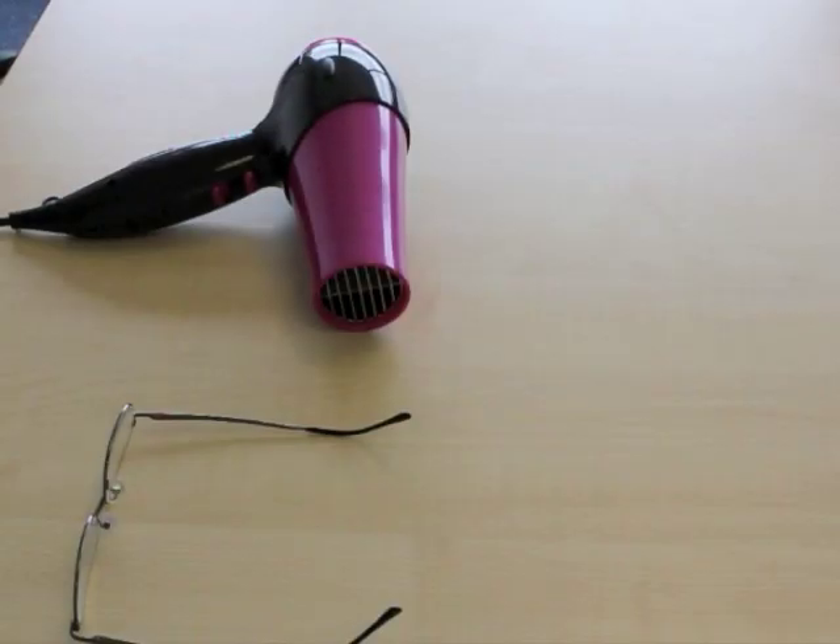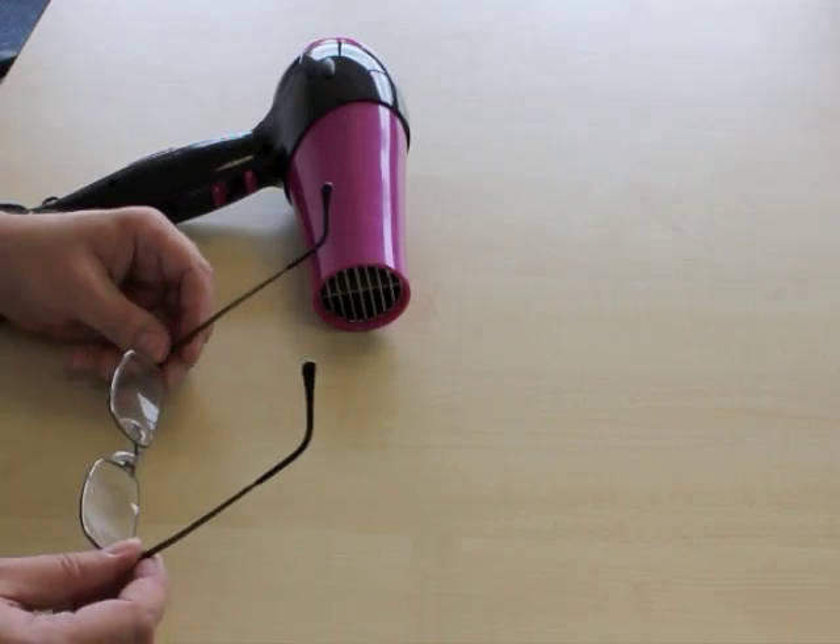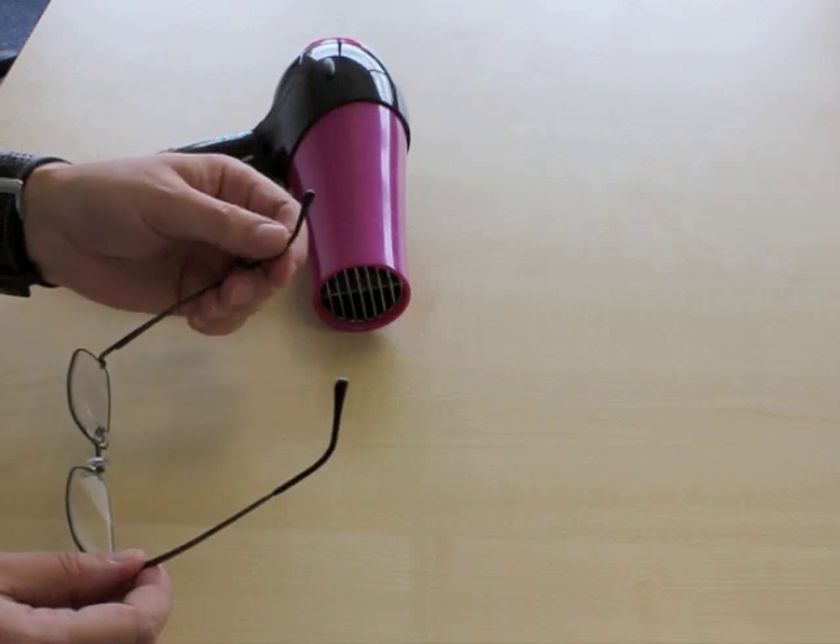Adjusting the length of the side of a pair of glasses is very straightforward. It won't take more than five minutes and all you need is a hairdryer. First, have a look at the glasses on and see where you need to adjust the side.